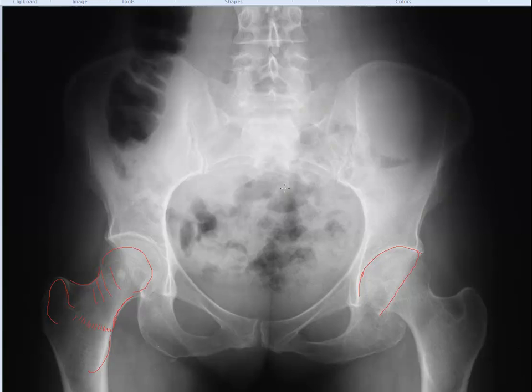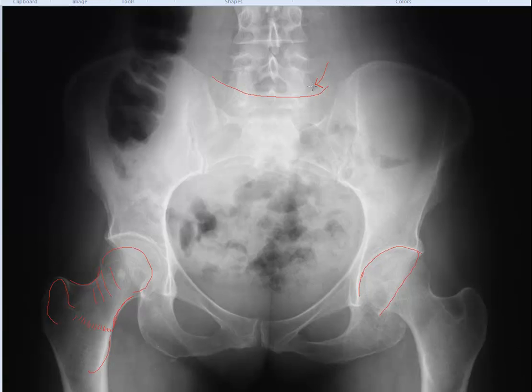Moving back to the more superior structures — here's the sacral base. Above that will be the lumbosacral joint where the L5-S1 disc space lives. This is a transitional area and anomalies can occur here. The most common is a lumbosacral transitional segment, meaning the last non-rib-bearing segment or the first sacral segment may have characteristics mimicking the adjacent region. These segments can be partially fused, so no movement is expected at those locations. The AP view combined with an AP or PA lumbosacral spot projection will really help.